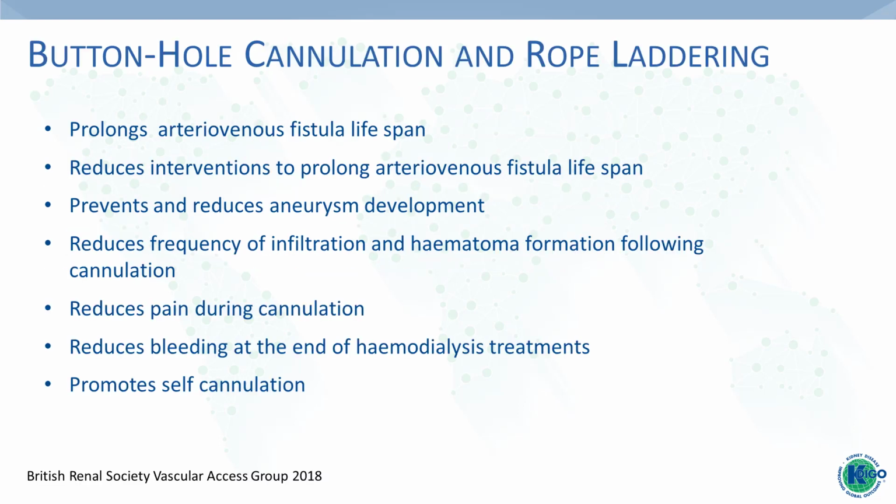I've included here buttonhole cannulation and rope laddering because that does seem to prolong AV fistula life. It can only be used in AV fistulas and only in people who self-cannulate with blunt needles. So it's not for everyone, but it does seem to prevent aneurysmal development and reduces pain during cannulation, which is also something that patients complain of. So I think if people can do it, it's something that's worth considering.